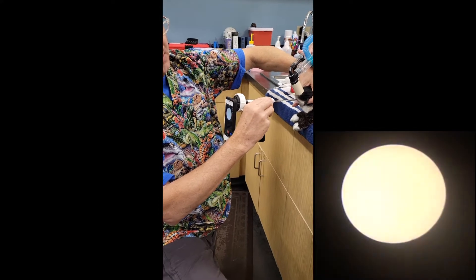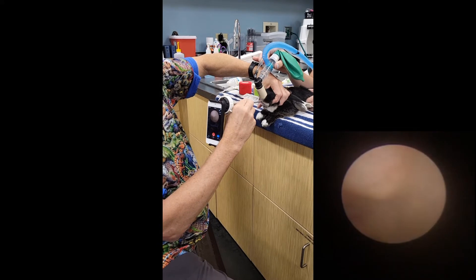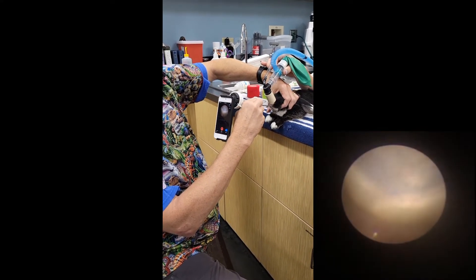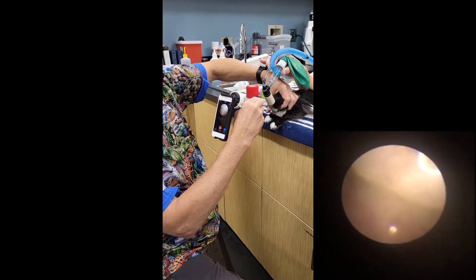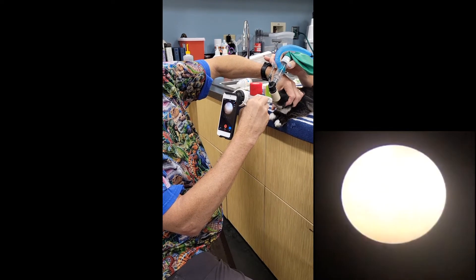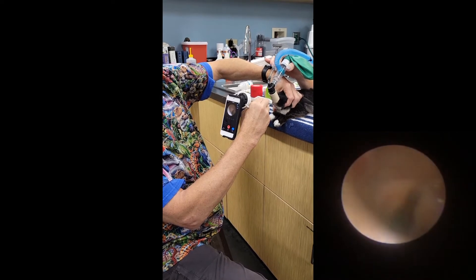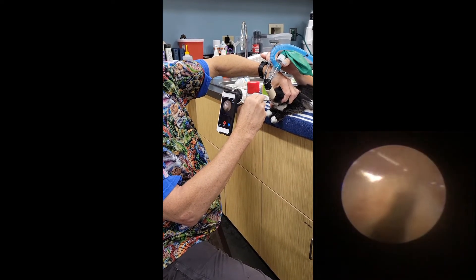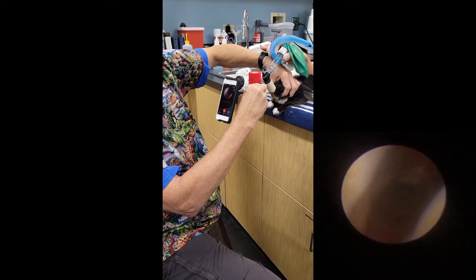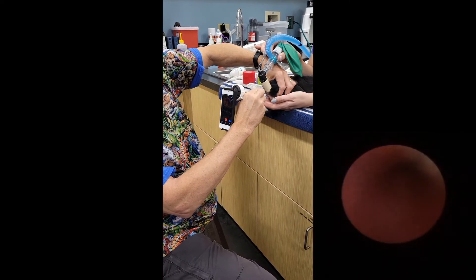I'm going to follow that seam back and quickly get to the back here where things open up. There's a tonsil here, tonsil here, and straight ahead is the epiglottis trapped by the soft palate. We're going to advance, tip elbow down, and liberate the epiglottis. The soft palate is up above. We're going to go into the widest part of the glottis, into the trachea — and we're intubated.